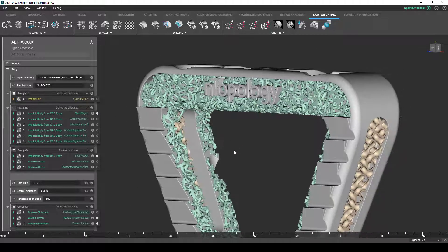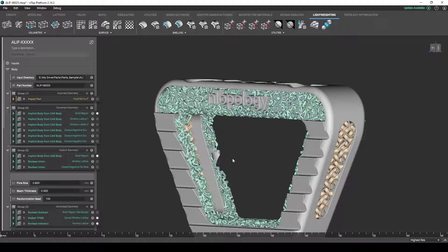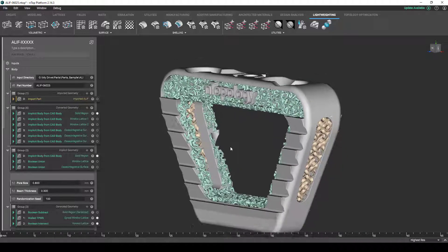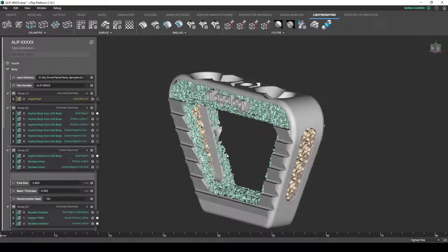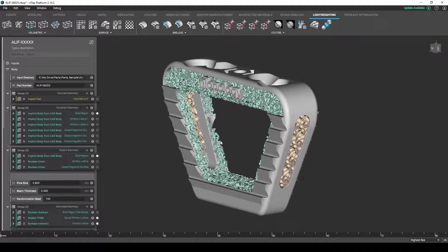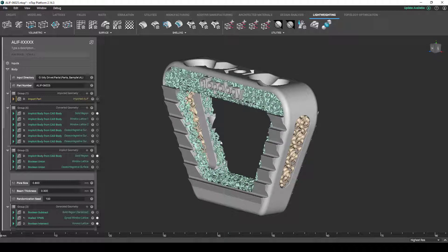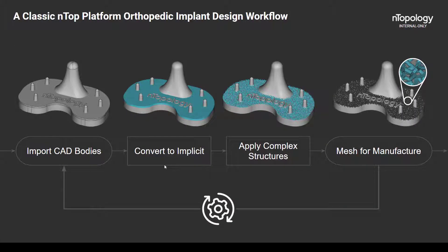Now that that is done, a final boolean operation is performed to combine all of these solid and lattice bodies together into a single unified part. And then we're going to mesh this part to create an STL. Now, when we compare this to the classic design workflow that we described earlier, we seem to really have hit all the marks, right?